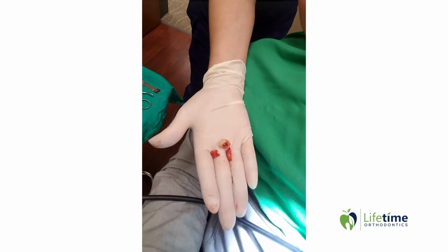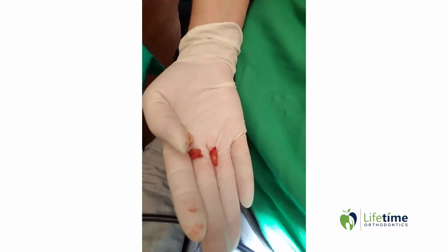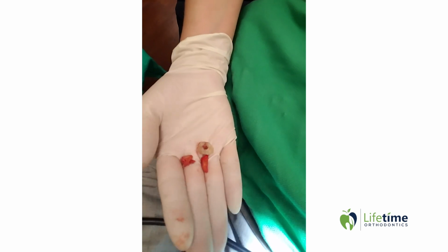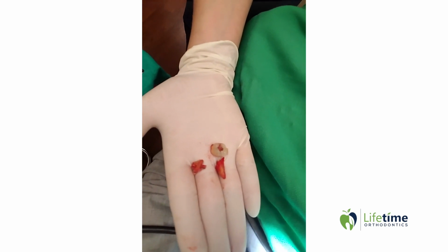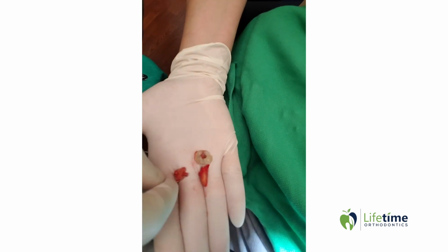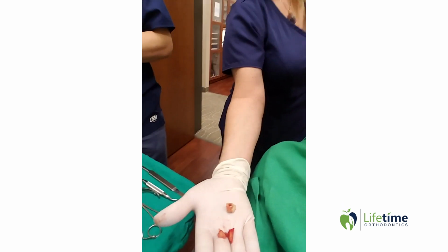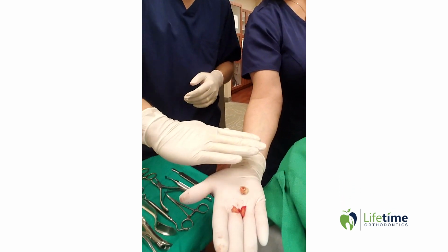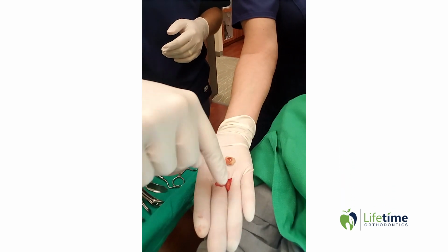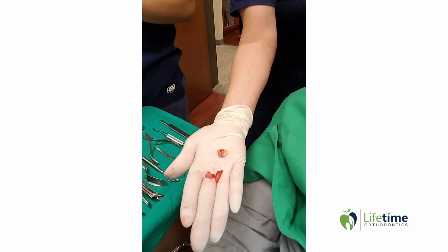Okay, there's the tooth. Let's talk about that tooth really quick. You can see there's only two roots there because we talked about the apicoectomy, and we're going to take an x-ray just to make sure here in a second. But that palatal root, mesiobuccal root, crown. You just tell them what you had to do. You had to section that crown, right? Yeah, cut the head of the tooth off, and then we sectioned palatal from buccal and were able to wiggle those guys out of there. Yeah, exactly.